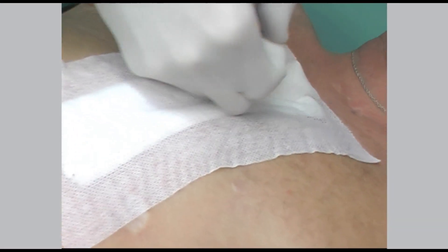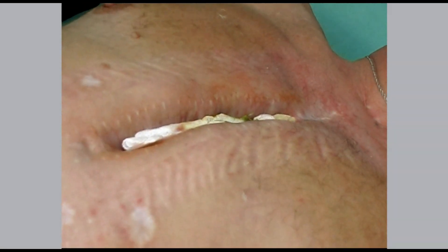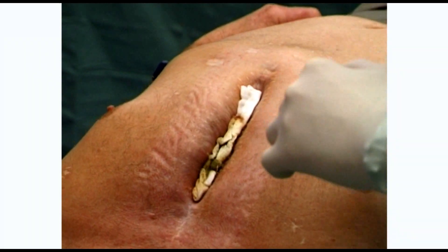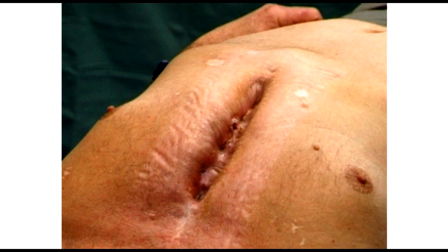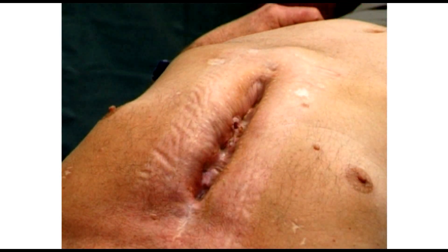Hiodyne is applied directly to the fistula. One milliliter of the preparation is applied to each fistula. The amount of the hiodyne preparation is determined by the size of the wound. An amount sufficient to fill the wound should always be applied.